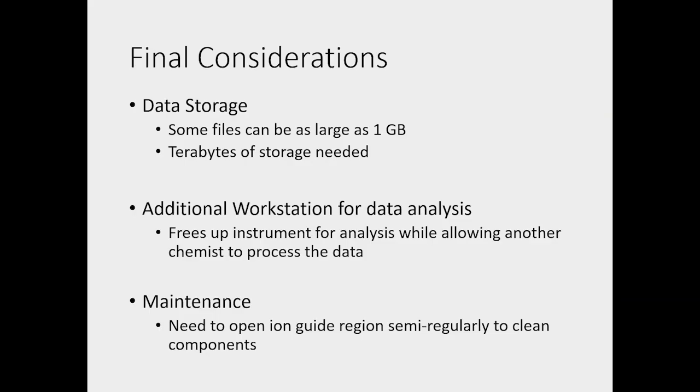As Jennifer was talking, I realized I should have mentioned that when we analyze our sample within that minute run, we do one dip of the internal standard, which acts as our negative control. Then we do 3 dips of the sample, and then we extract all of the sample together and the internal standard separately.